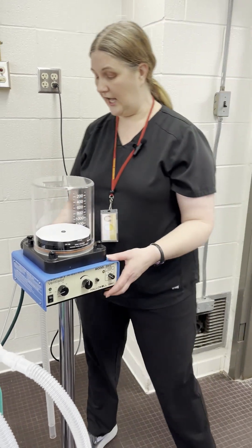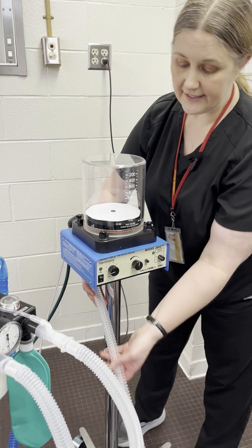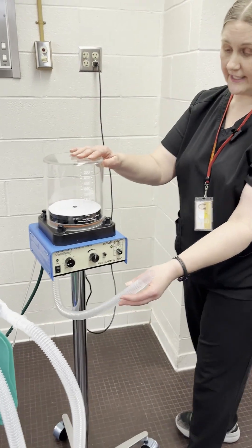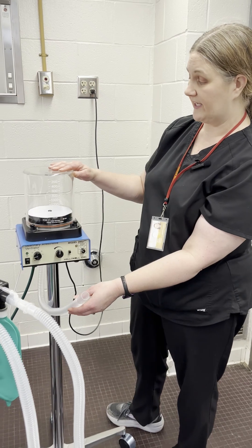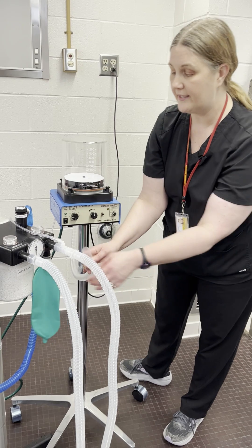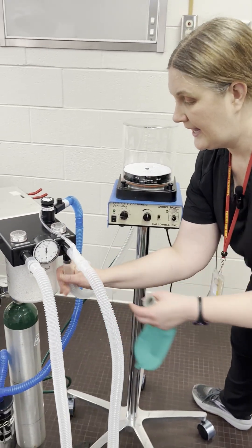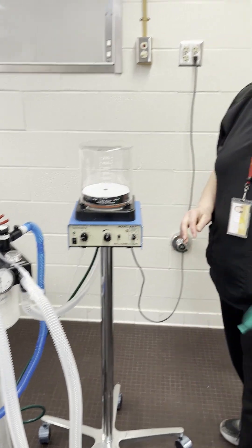And then we need to attach the patient. The goal of the ventilator is just to take the place of us giving a breath. How we give a manual breath to the patient is to squeeze the reservoir bag, so we can simply remove the reservoir bag and attach the ventilator hose there.